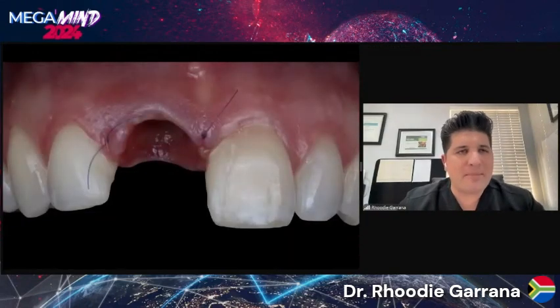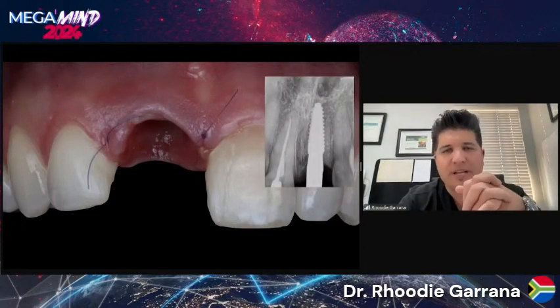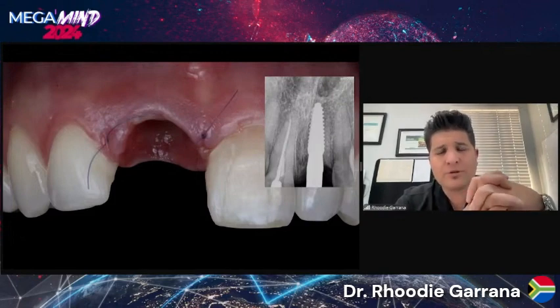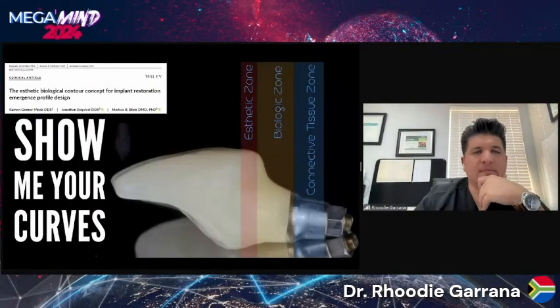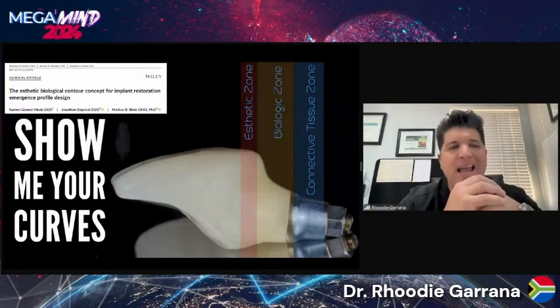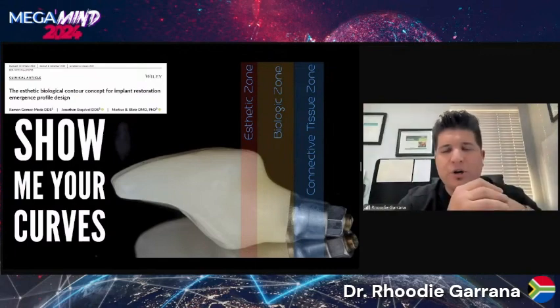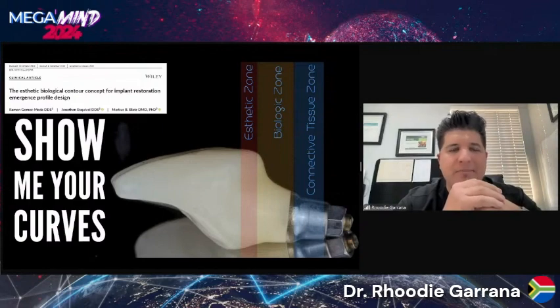When raising that flap, I make sure that it's as low trauma as possible. I then placed a Megagen AnyRidge implant into that site, suturing the papilla together. And now, at this stage, my Osstell reading is a lot higher, and having the implant encased in bone, I've got a much better chance of success. And so I can think about doing an immediate load restoration at this stage.